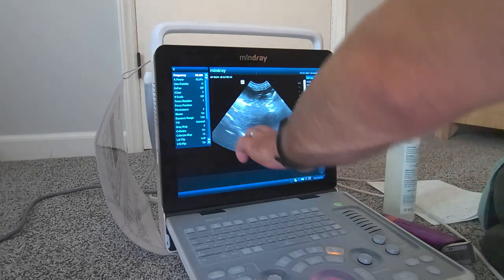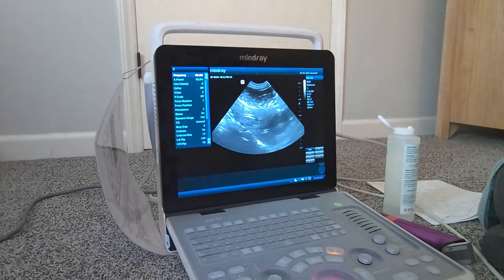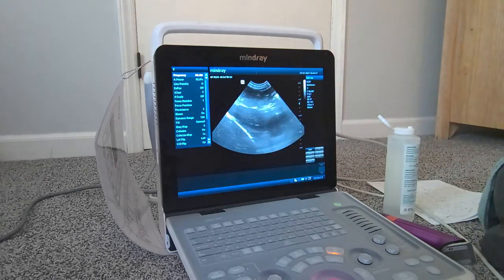Within the liver, you'll say, well, what can I actually see in here? You see these tubular structures. There's a nice one right there in the middle that has a hyperechoic wall. Your portal vessels are going to be the ones that have these nice hyperechoic lines on them. So I can see all these portal markings, and that's what makes that rough echotexture look, because you see these hyperechoic portal markings and portal vessel walls versus the smooth parenchyma around them, which gives it that rougher appearance.